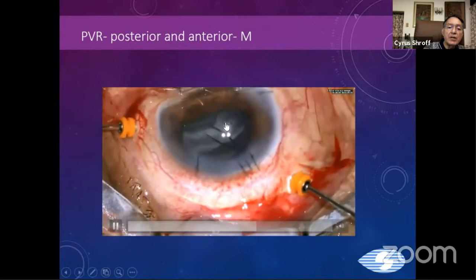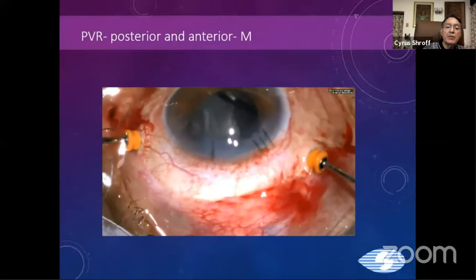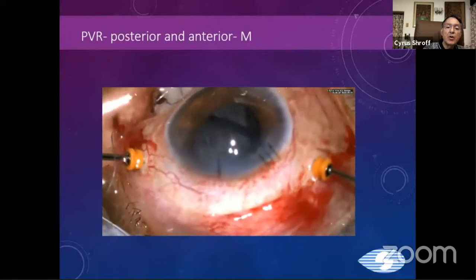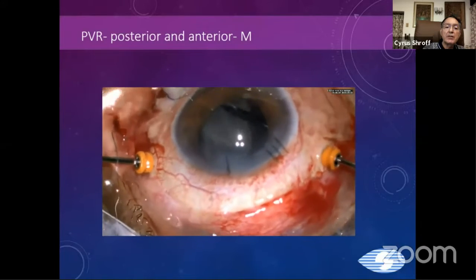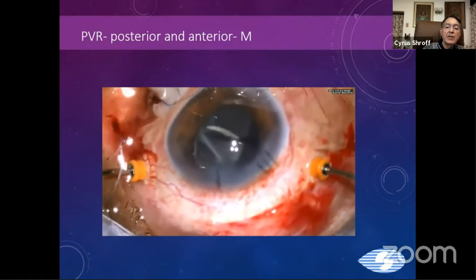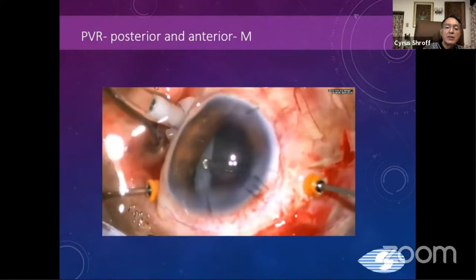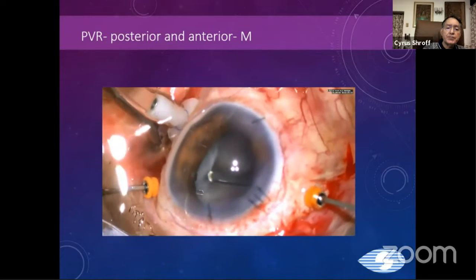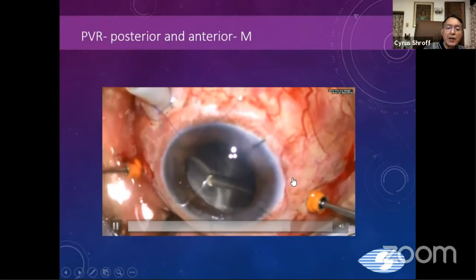We can work under microscope light with one or two instruments, with the forceps and scissors, or even two forceps and a stretching maneuver, so that traction in the anterior space is relieved, and then the scissors remove that tissue. Having done that, the anterior retina also becomes much more mobile.